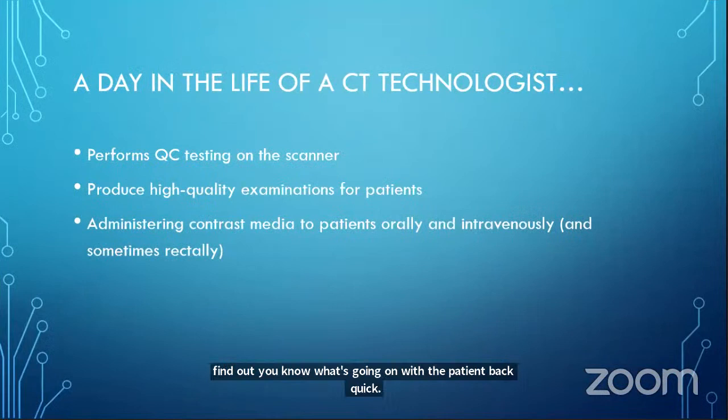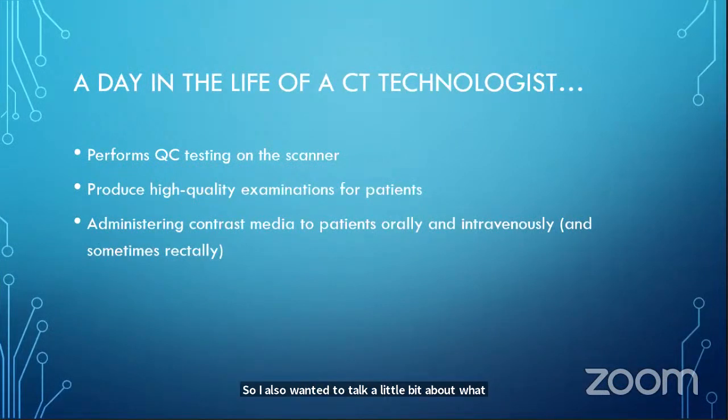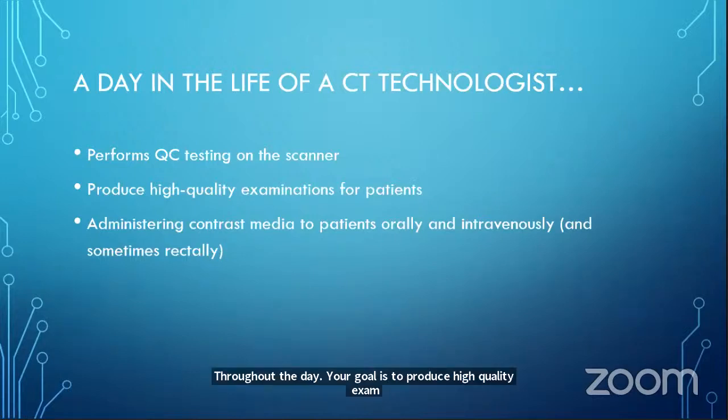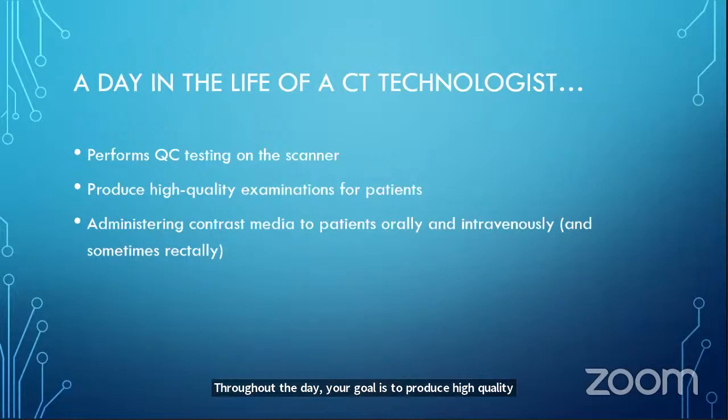So I also wanted to talk a little bit about what happens for a CT technologist during the day when you come in to work. So you come in the morning and you perform some QC testing on the scanner. Throughout the day, your goal is to produce high quality examinations for the patients. And we do this by making sure that we're doing the right patient and the right protocol.